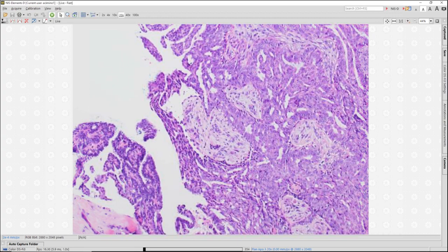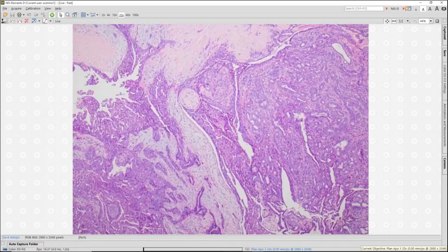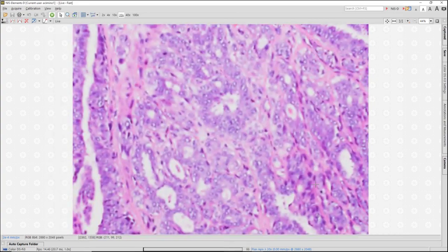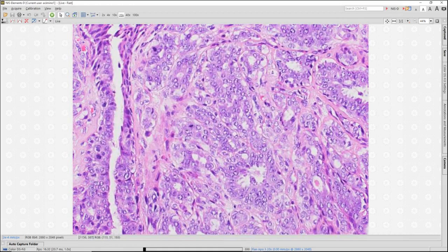So this is, just as in those core biopsies, an example of an intraductal papilloma where I see hyalinization and sclerosis of the cores, fusing of some of the cores, back-to-back glands that still maintain myoepithelial cells. In this case, they're rather cleared out.